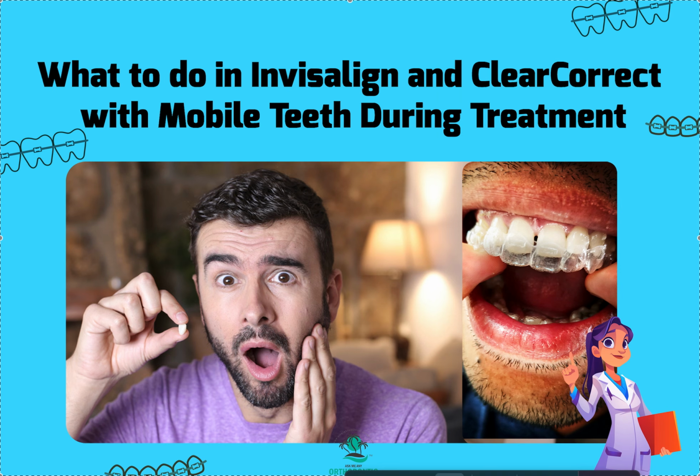So hang in there. First thing I like to do whenever a doctor tells me, hey, my patient's starting to get mobile teeth, is I say, well, okay, we need a little more information. What is mobile? What does that mean? Talking about light mobility, like a 1 plus, 2 plus, and of course 3 is depressible, right? That's a big no-no. So I'm okay with the 0.5 to 1.